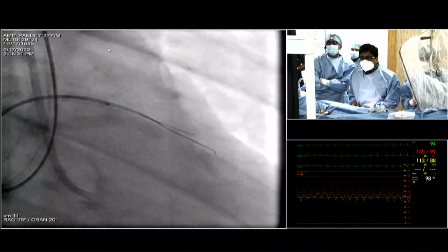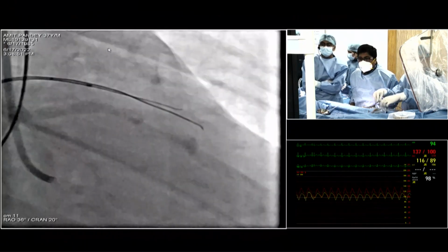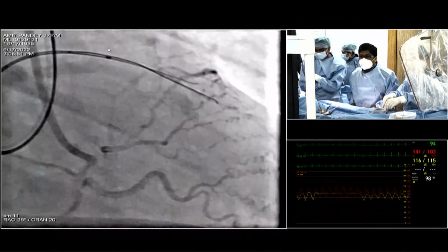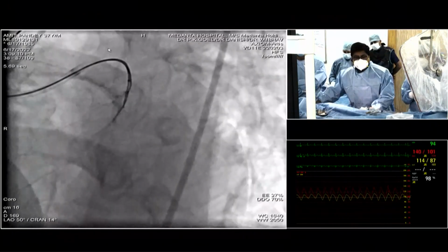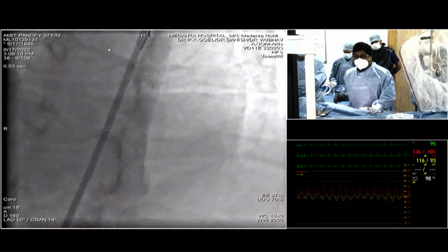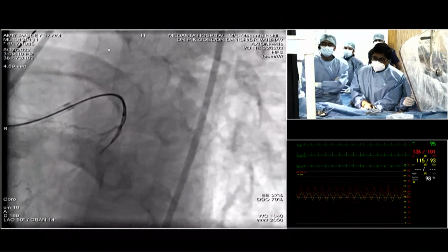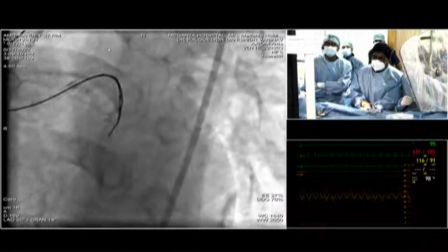Dr. Goel, is it still the Conquest Pro, or what wire do you have? We had just joined you for a few minutes. It looks like you're across. Dr. Goel, can you hear us? Yes. Great job. Fantastic, Dr. Goel. Looks like you're in.